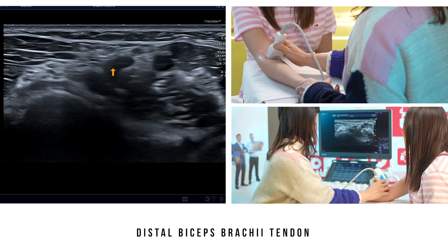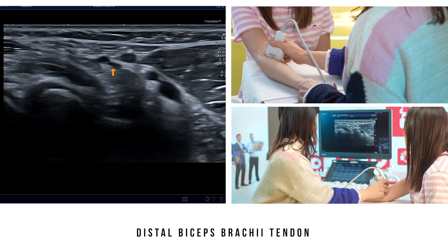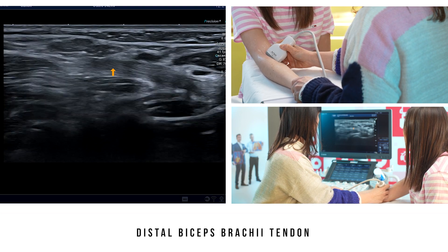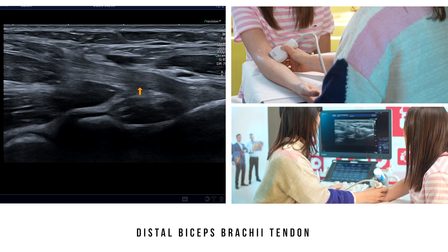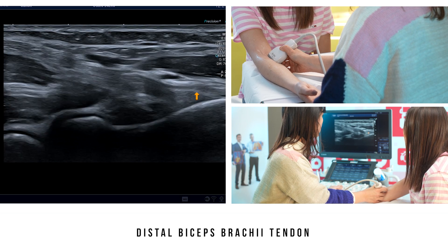More distally, we reposition the probe on the middle third of the tendon, then rotate it 90 degrees. This aligns the probe with the long axis of the tendon until we reach its distal insertion at the radial tuberosity, where we can see the fibres of the long head deeply and those of the short head superficially, which insert more distally.